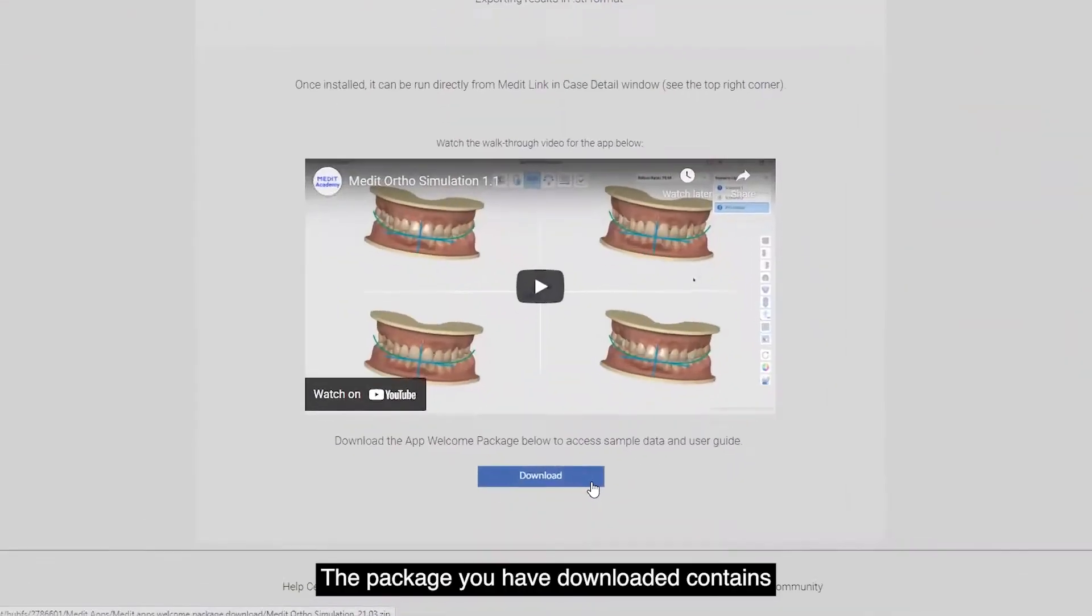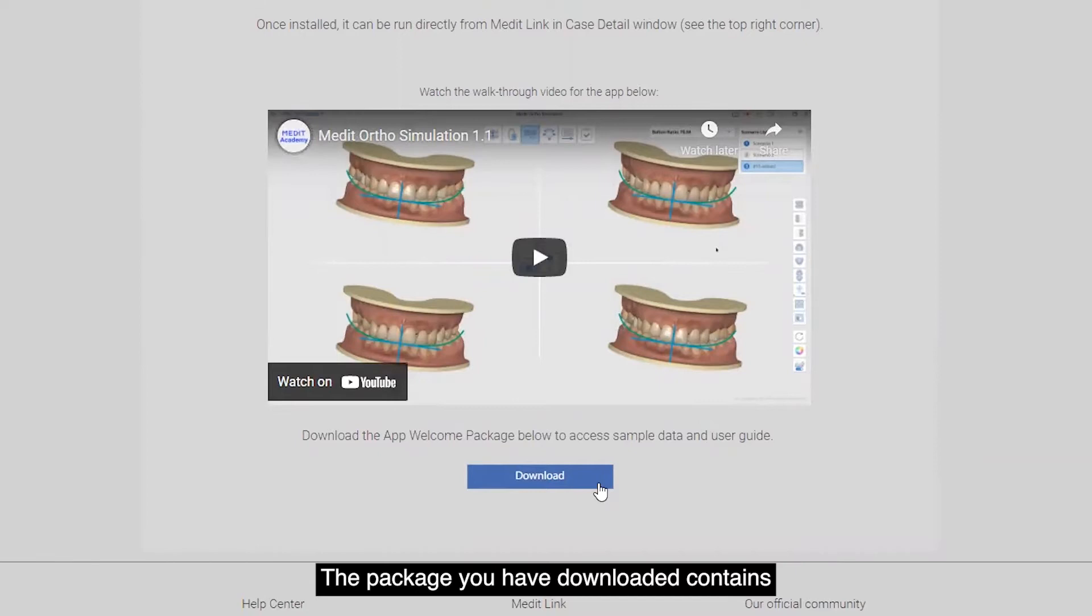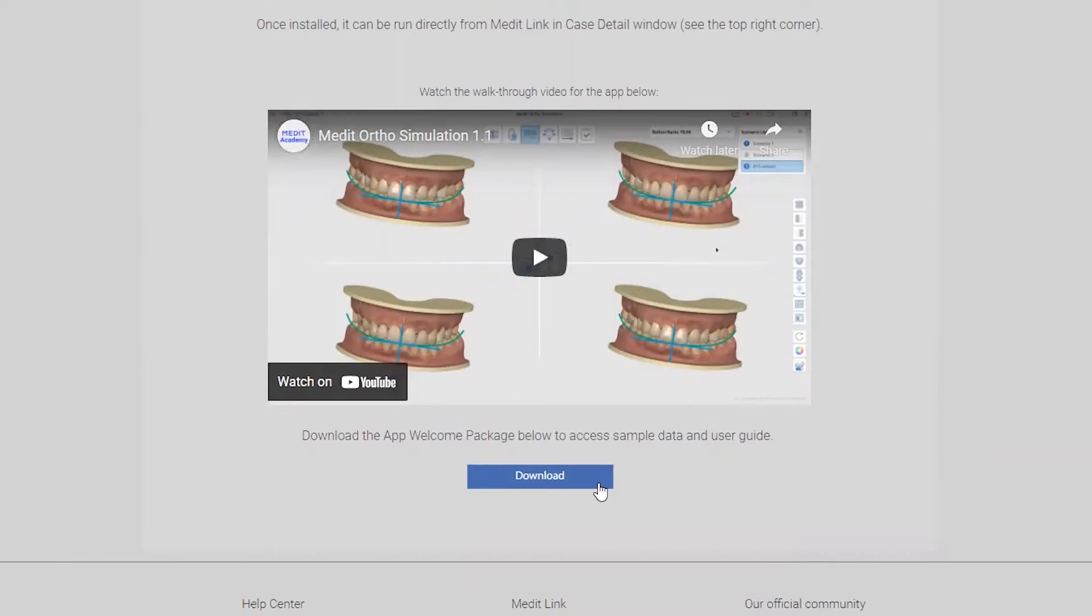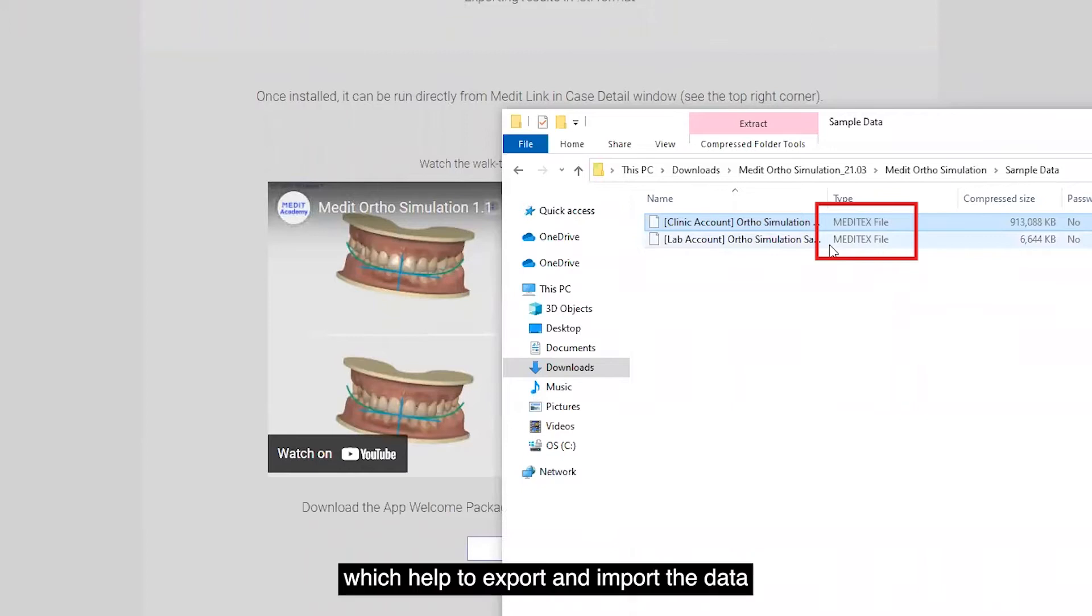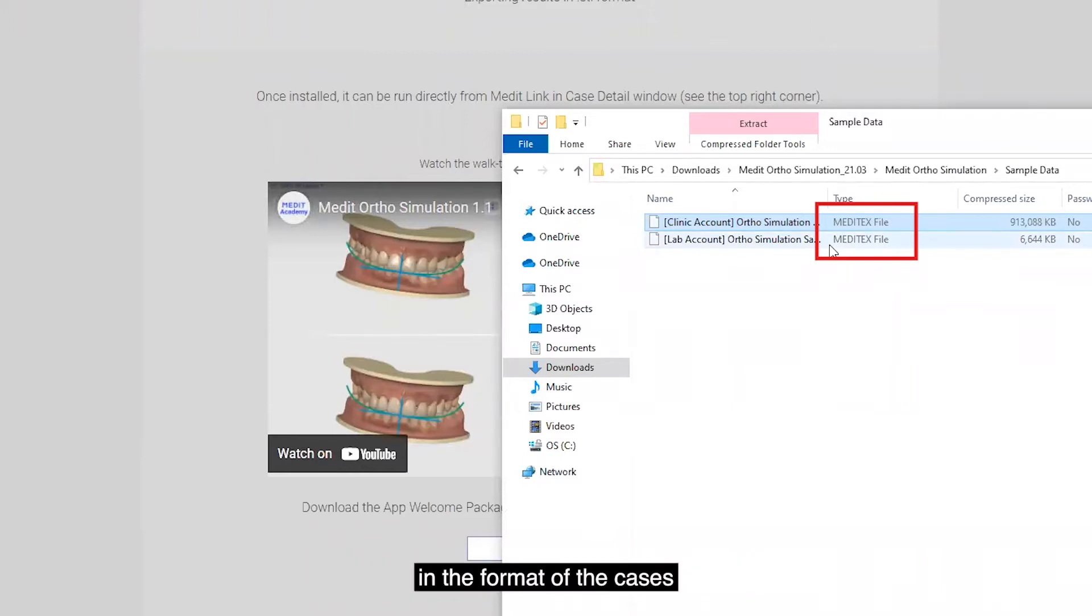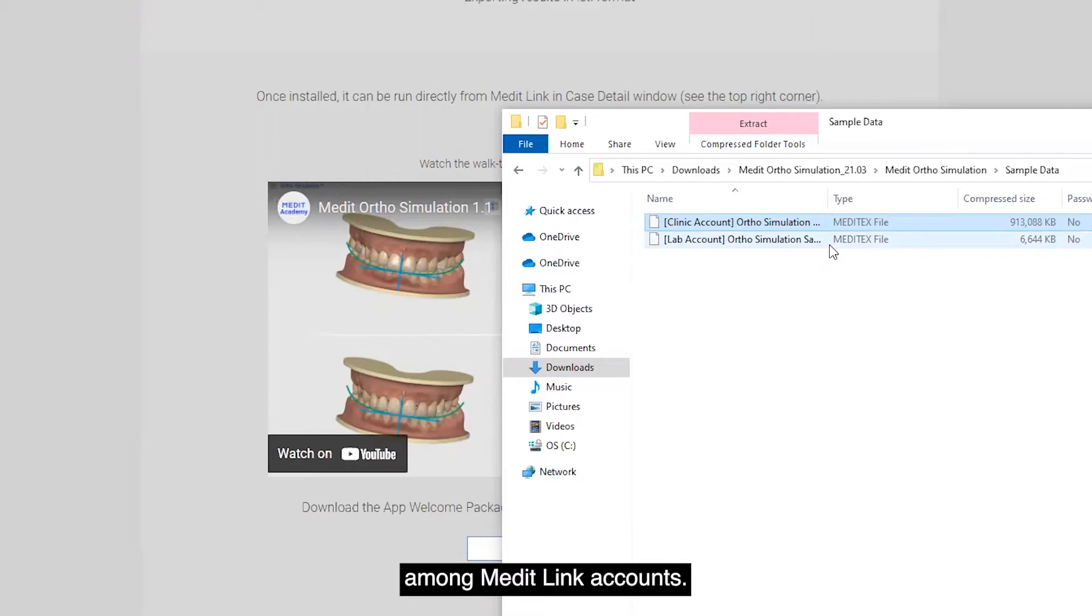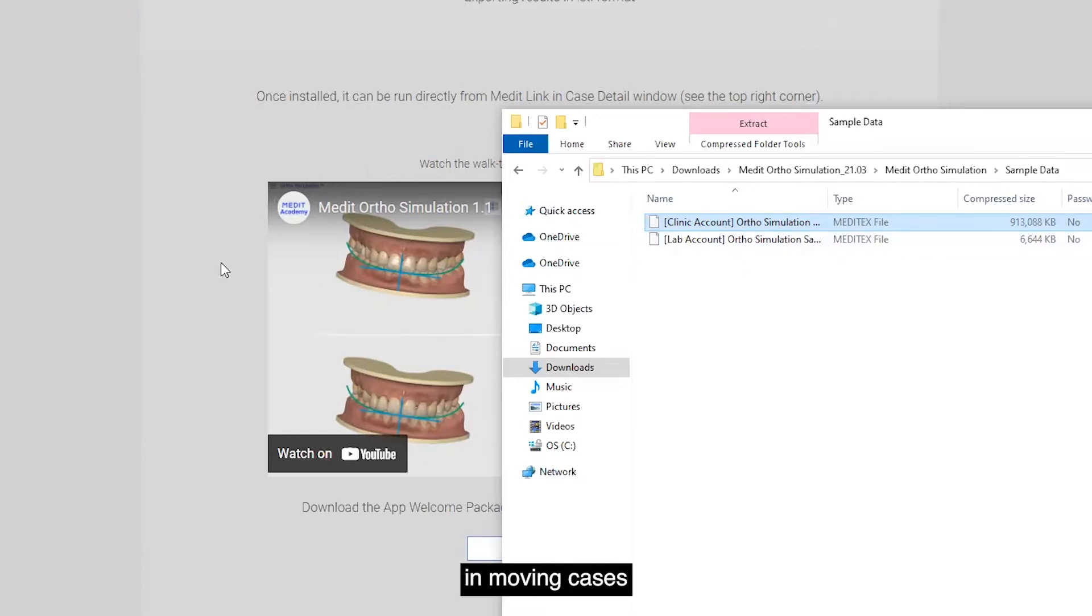The package you have downloaded contains a Meditext file, which helps to export and import the data in the format of the cases among Medit link accounts. Also, this is useful when moving cases between accounts for backup.